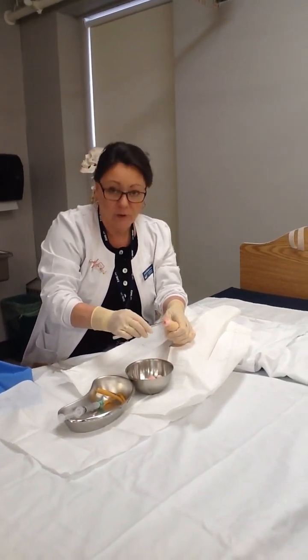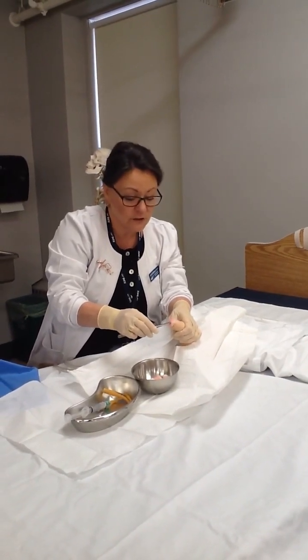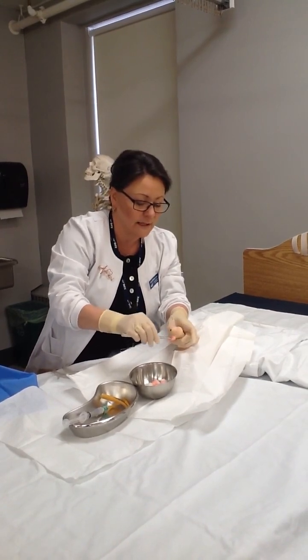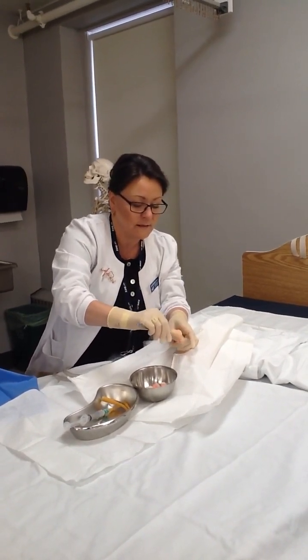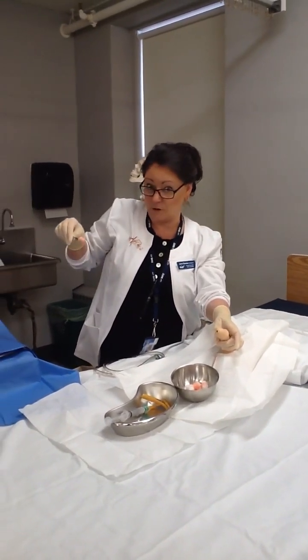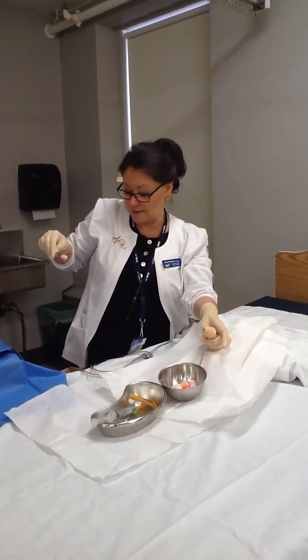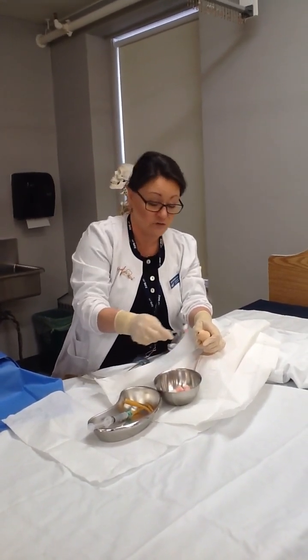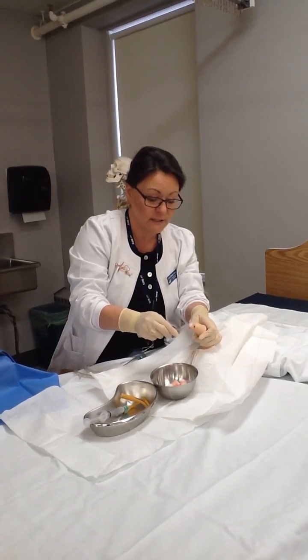right in the center, apply some pressure, and then a circular motion all the way down to the bottom of the glans. One movement. Keep your forceps pointed down. Keep your arm nice and high above your garbage and drop that in. We're going to do the same thing again. Start right in the center, apply pressure, and use a circular motion.